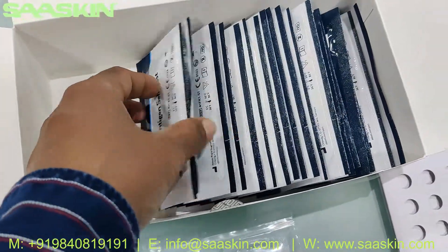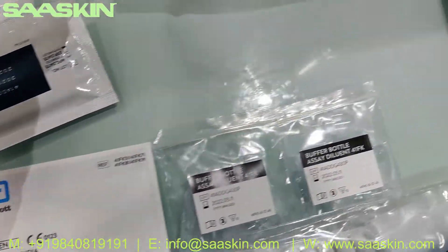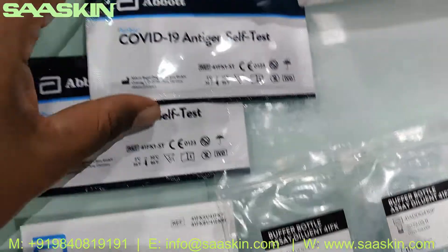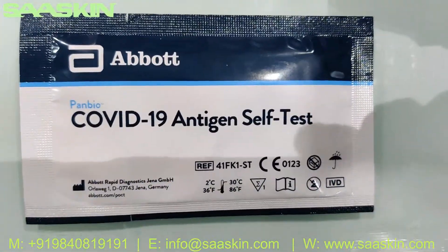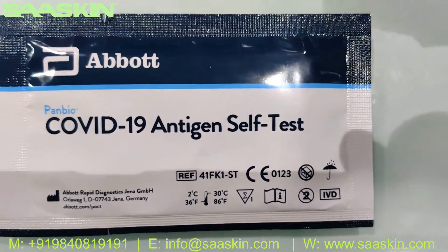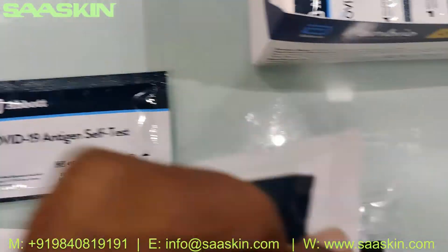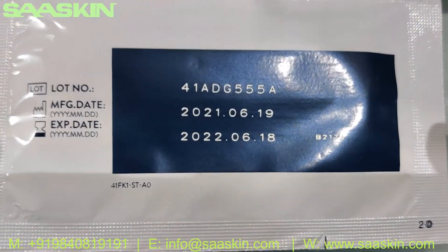Let me take out two test cassettes to show you. This is how the test cassettes look like. It says Panbio COVID-19 Antigen Self-Test on the front. The other side contains the manufacturing date and the expiry date.